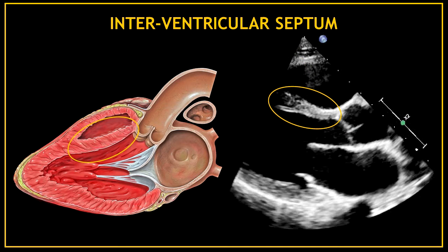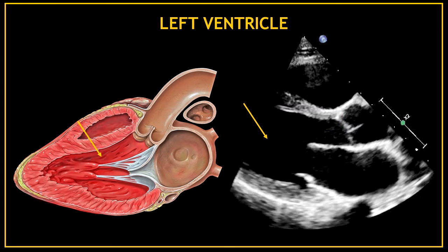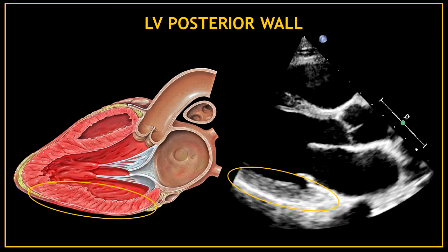This bright thicker line in the middle is the anterior interventricular septum. This bigger black space under the septum corresponds to a chamber — this chamber is the left ventricle. This thick area is the left ventricular posterior wall.